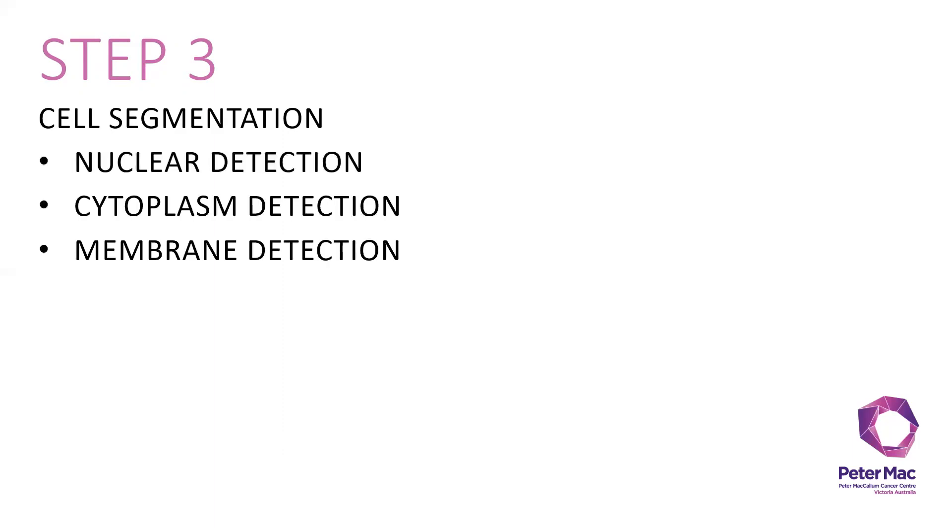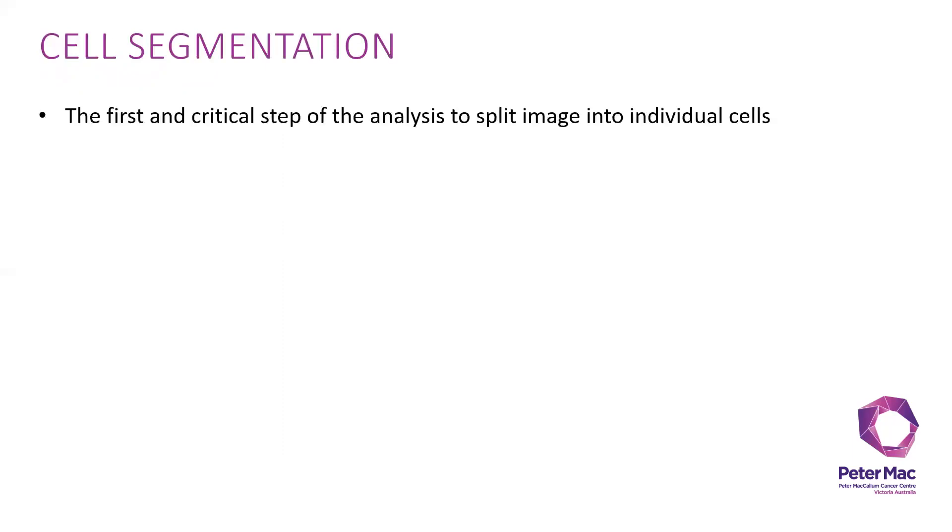After those steps, you can move on to cell segmentation, which has three different parts: nuclear, cytoplasm, and membrane detection. First, what is cell segmentation? This is the first and critical step of the analysis to split image into individual cells.